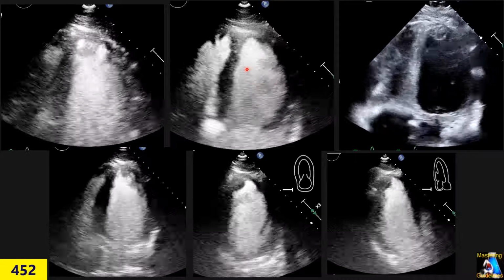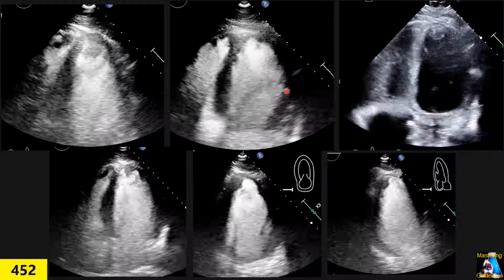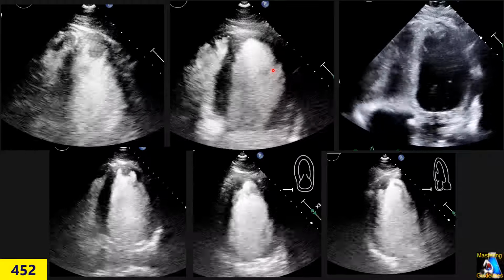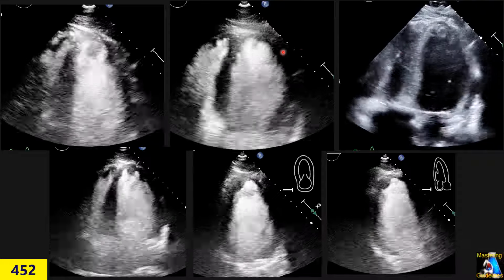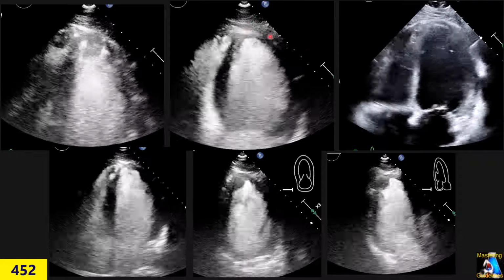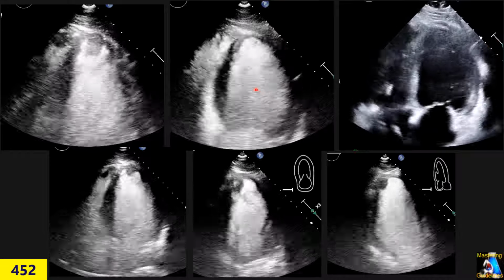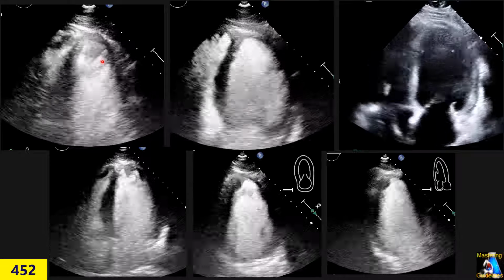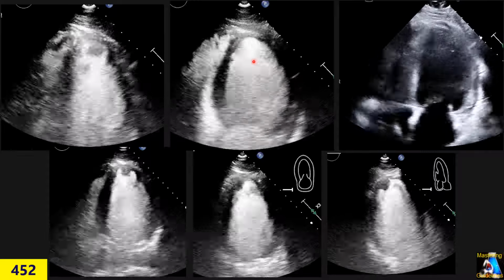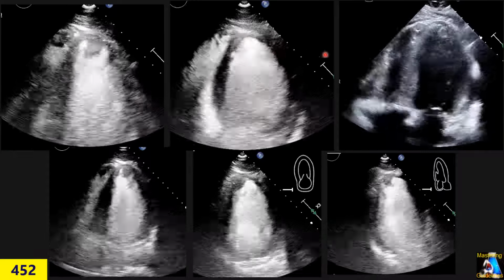So why don't we have this one? We always say Definity is to completely, 100%, rule out or confirm thrombosis or any intraventricular structure abnormality. On 2D we have it, but on this view we don't have it, but in this view we have it. What is going on and why? And what is the point of this study?